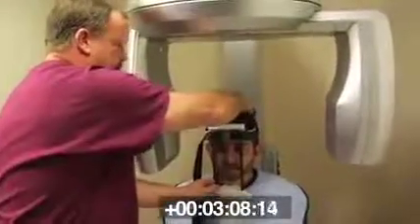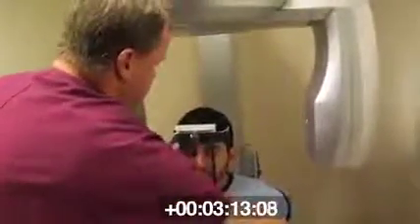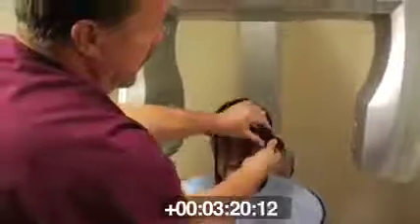And we're going to try to extend our patient's neck to the fullest there. Tip it forward till you touch right there. I'm going to run this up just a little. Still touching on the front? Okay, so we're still touching. We have a little strap we put around the head just for stability. And basically we keep this down low around the crown of the head. Put a little squeeze on it here. We'll tighten the arm. Make sure it doesn't move, and then we have a locking arm right down here that locks it in place. So now the patient's seated and ready to go.